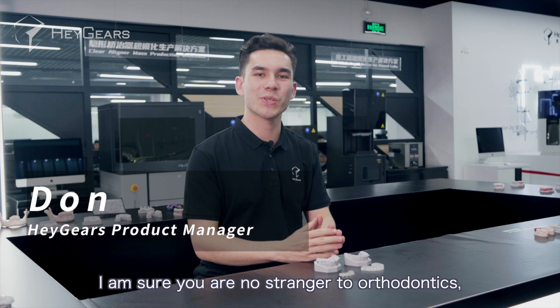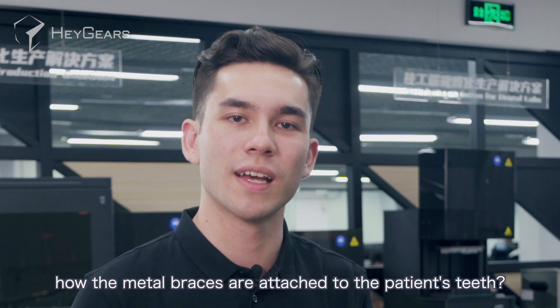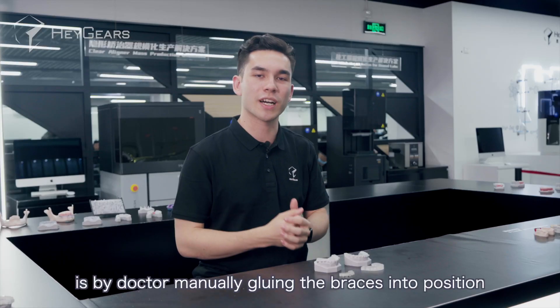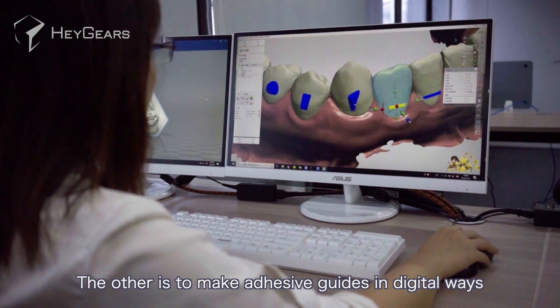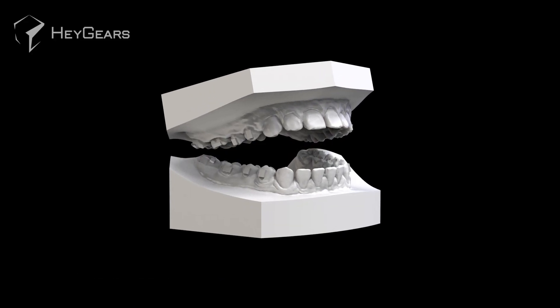I'm sure you're no stranger to orthodontics, but have you ever wondered how the metal braces are attached to the patient's teeth? At present, one of the two ways is by a doctor manually gluing the braces into position according to their experience. The other is to make adhesive guides in digital ways to assist the doctors to glue.